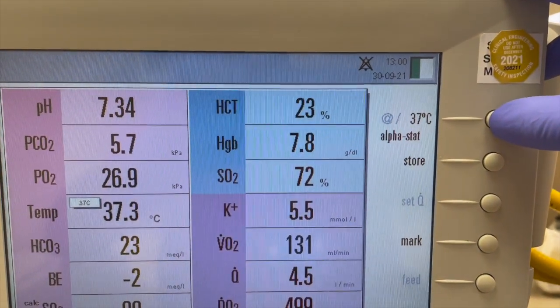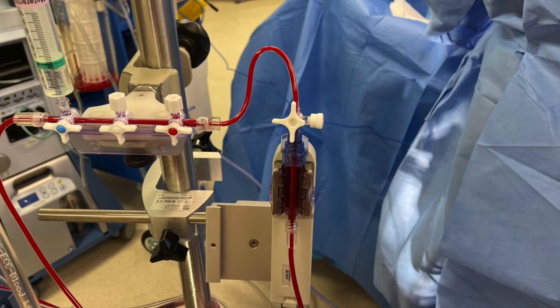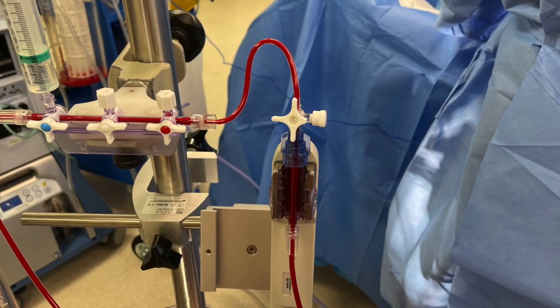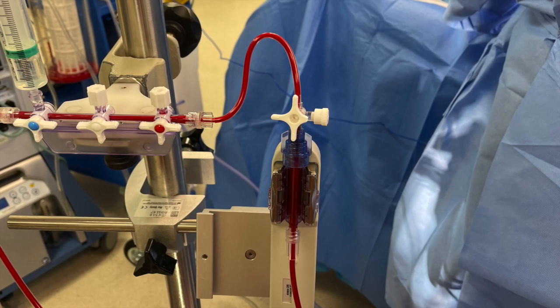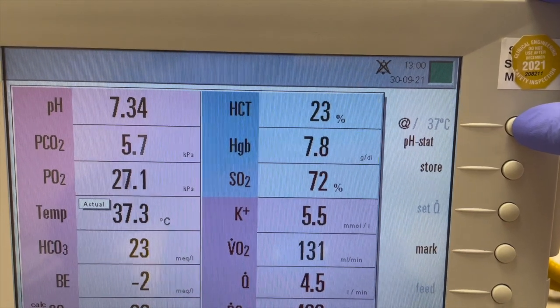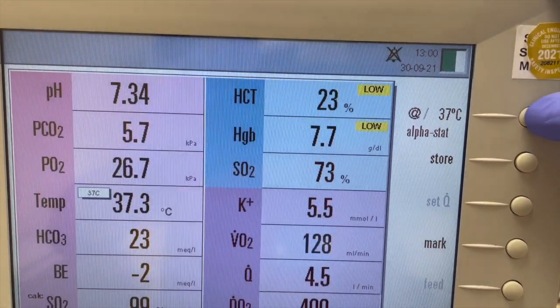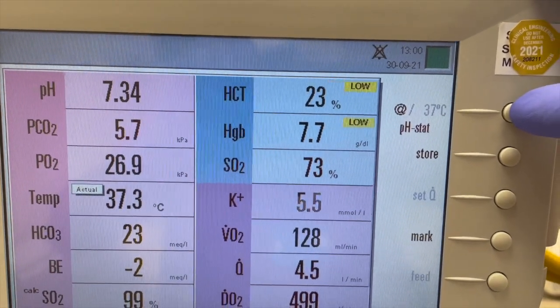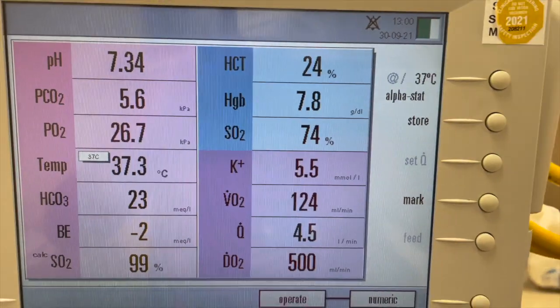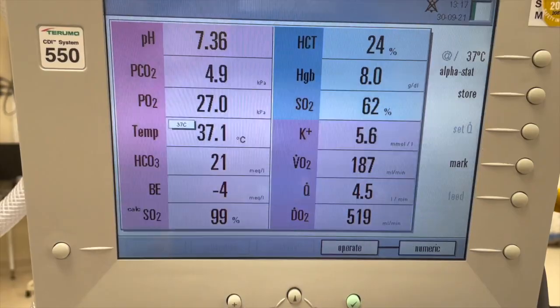Unique fluorescence sensor technology measures pH, pCO2, pO2, and potassium. Optical reflectance technology measures venous saturation, hematocrit, and hemoglobin. pH, pCO2, and pO2 are measured per second. Potassium is measured per 6 seconds. Venous saturation, hematocrit, and hemoglobin are measured per 18 milliseconds. The system display updates every 6 seconds.